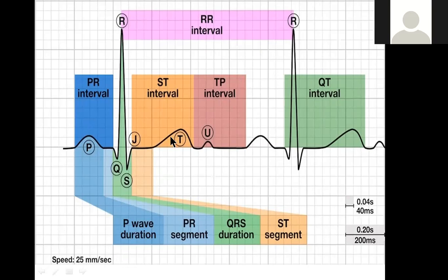This means that in 1 second, five large boxes will pass from the writing pin.